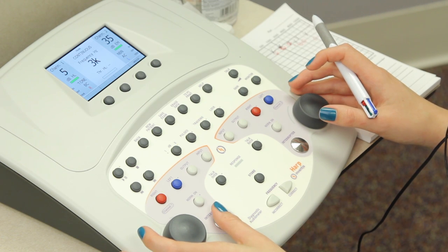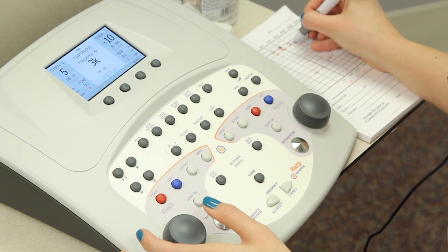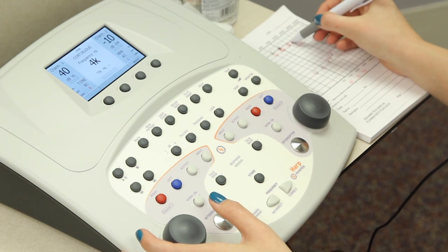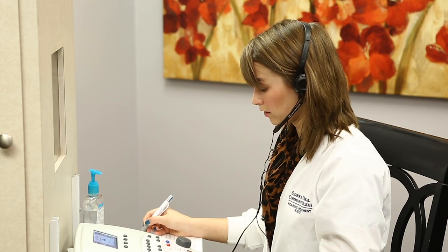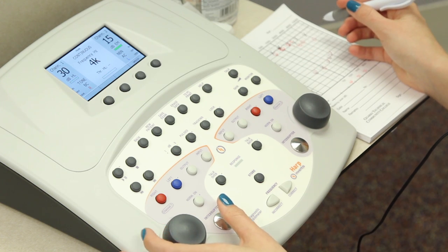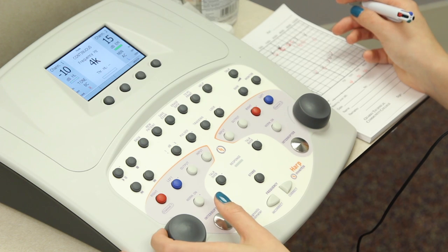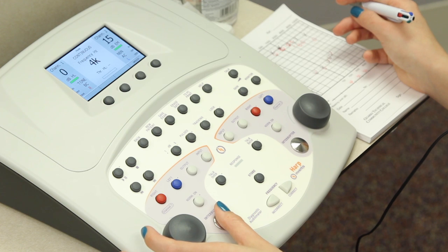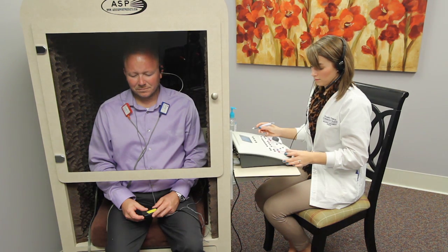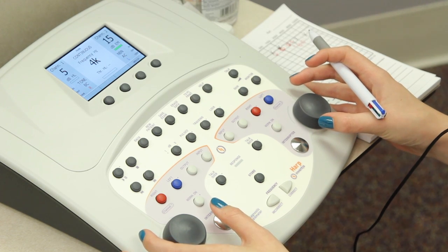At 4,000, left ear threshold is at 5, so we're going to add 10 to that and start masking at 15 decibels. We're going to increase masking by 15 decibels.